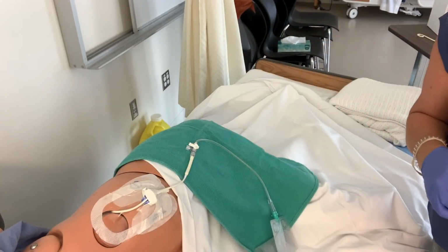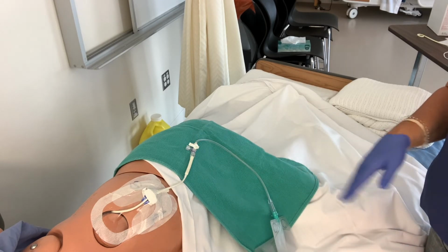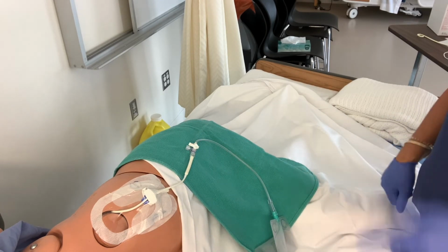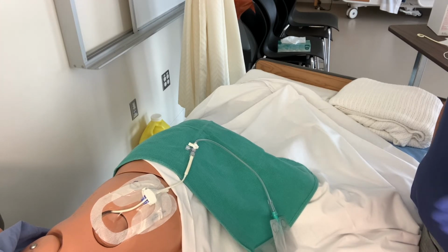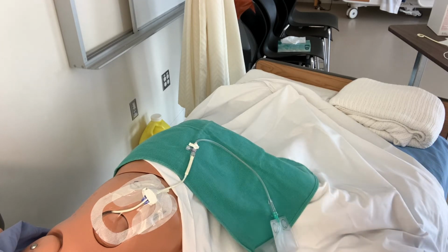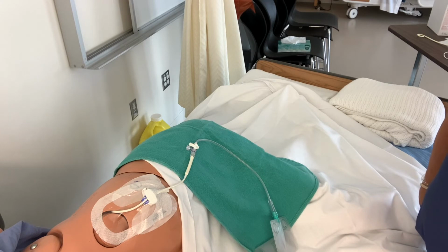Okay, everyone, this part of the video will deal with just the bag change. It is possible that we would just change the bag and tubing without actually changing the dressing. So again, remember, the dressing is changed every 7 days, unless there's drainage underneath it, it's not occlusive, it's lifting, it's not intact, or it looks like it needs to be changed. That's nursing judgment. We're going to change that, but otherwise every 7 days. Bag and tubing is changed every 3 days.